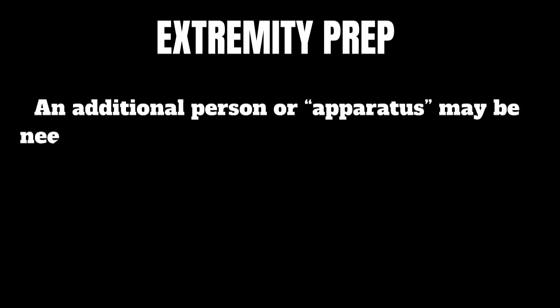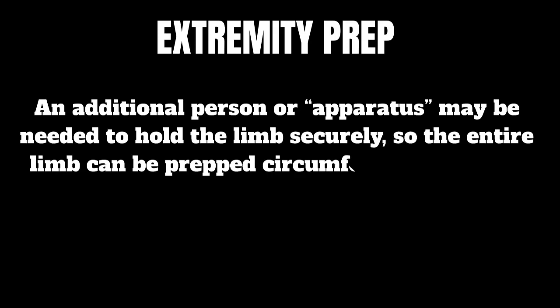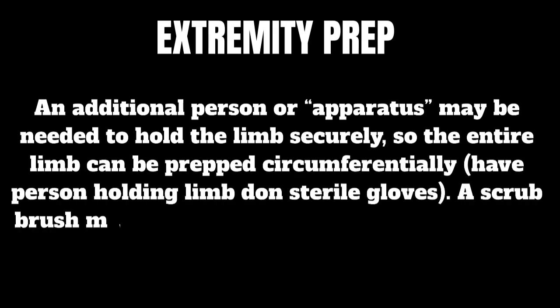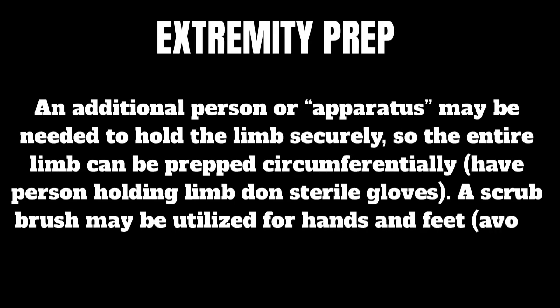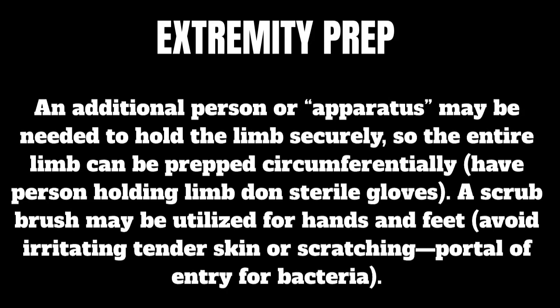Extremity prep. An additional person or apparatus may be needed to hold the limb securely, so the entire limb can be prepped circumferentially. Have the person holding the limb don sterile gloves. A scrub brush may be utilized for hands and feet. Avoid irritating tender skin or scratching, a portal of entry for bacteria.